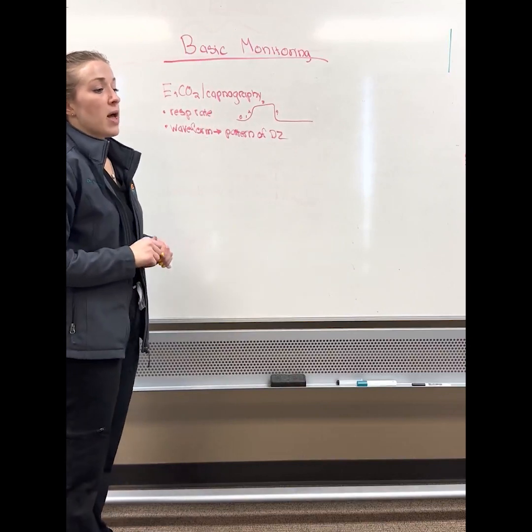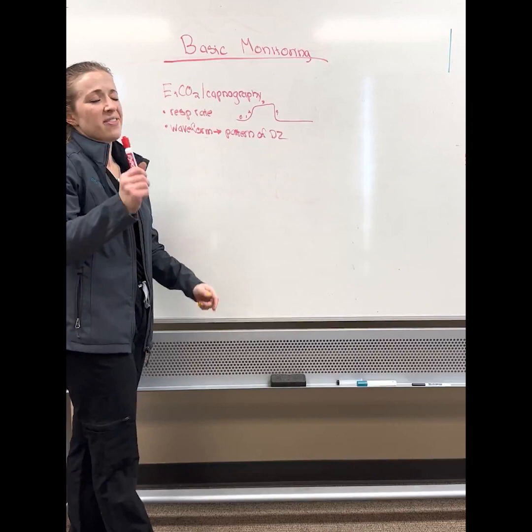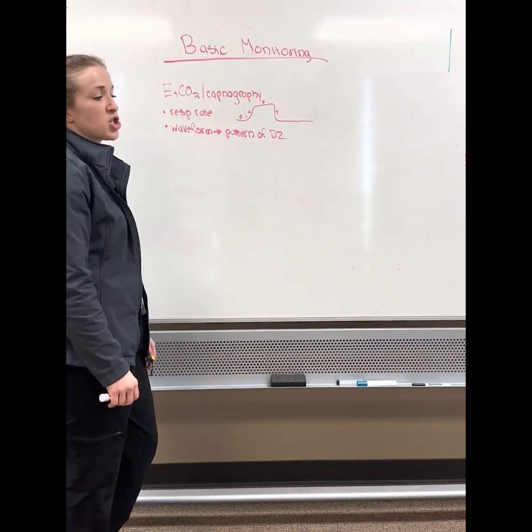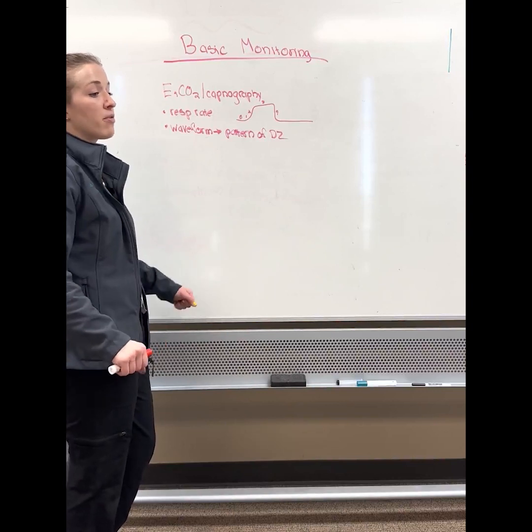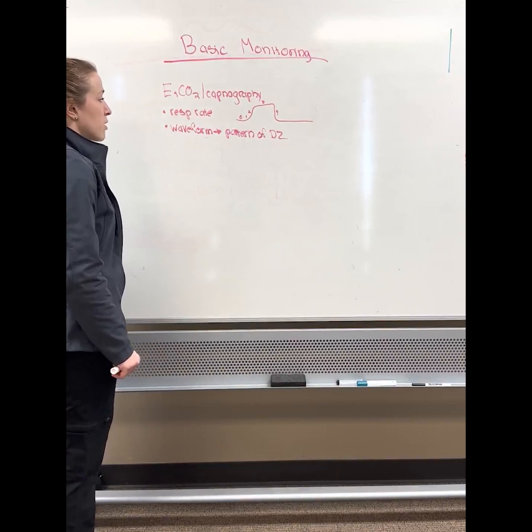So think about end-tidal capnography, not only about breathing, but about cardiac output. That's why animals with really low blood pressures will sometimes have CO2s in the 20s. It's just because the heart is not able to pump all of that CO2 from the rest of the body outward. So that's kind of capnography in a nutshell.